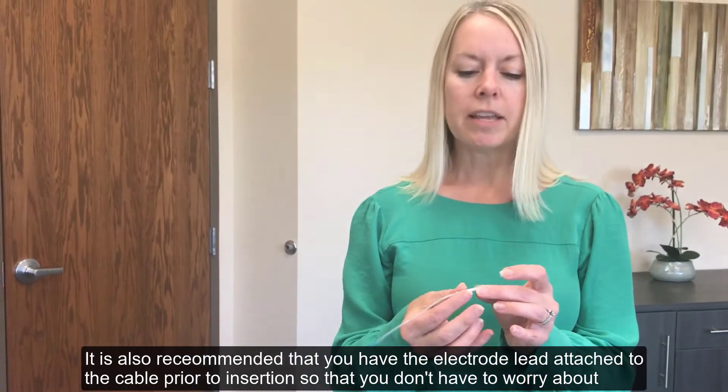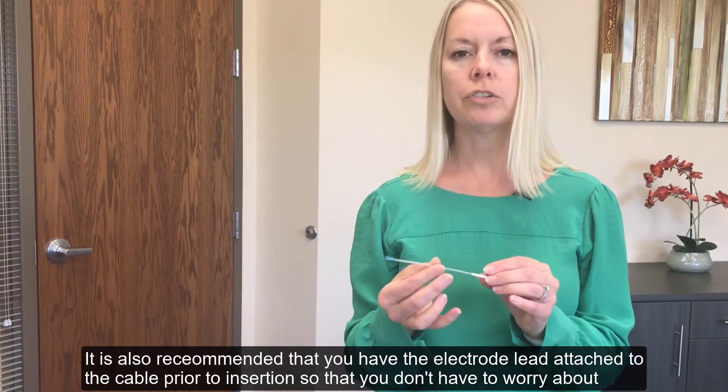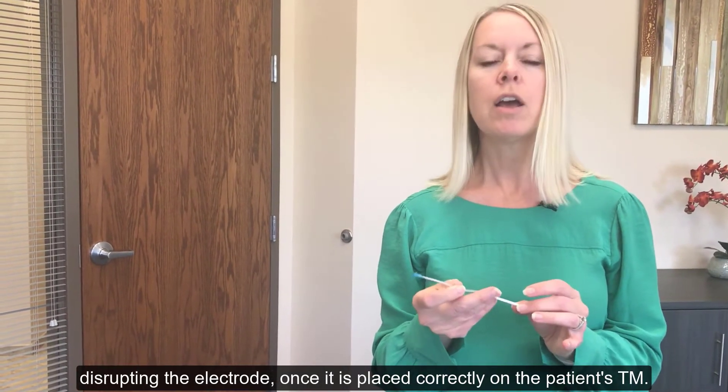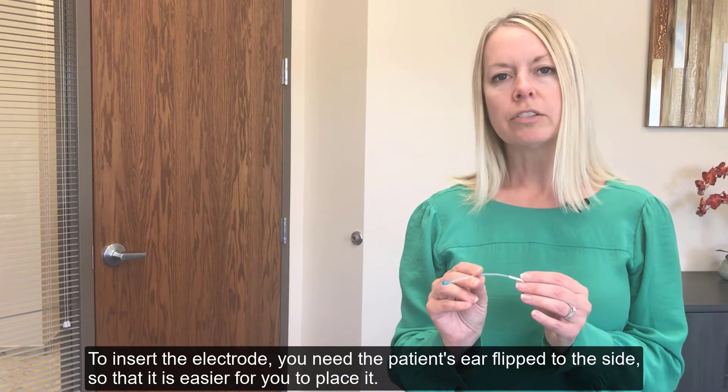It is also recommended that you have the electrode lead attached to the cable prior to insertion, so that you don't have to worry about disrupting the electrode once it's placed correctly on the patient's TM.